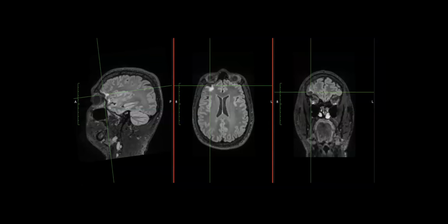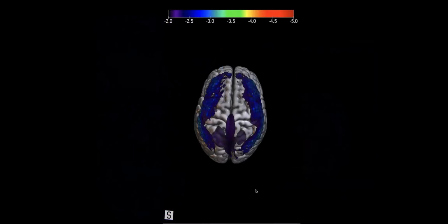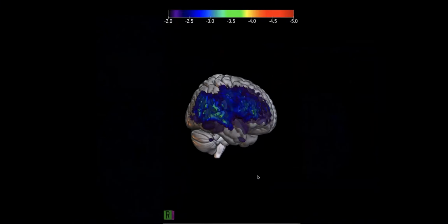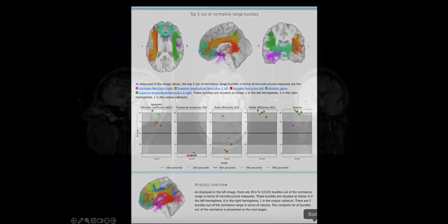And again, this is an example of a case where we know there was a traumatic brain injury on conventional imaging seen by this abnormally low volume and gliosis, and we can see abnormally low blood flow in the same areas. The Z-score map from the ASL analysis shows additional areas of abnormality. And we can see that in the 3D video rendering as well, showing this asymmetry, but worse extent of low blood flow in the ASL. We can see that in the DTI analysis, there were 13 out of 33 abnormal bundles, including in commonly injured areas in the frontal and temporal lobe white matter tracts.